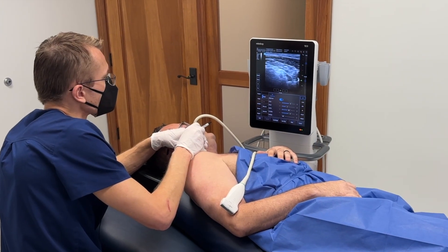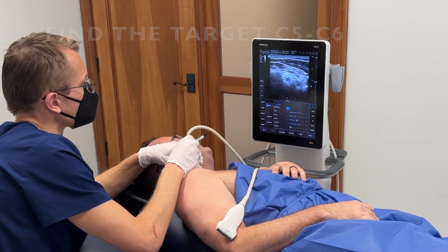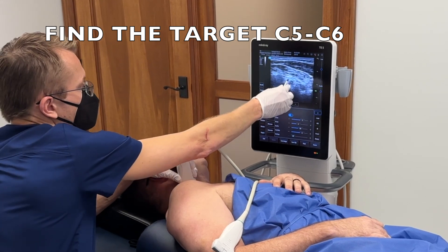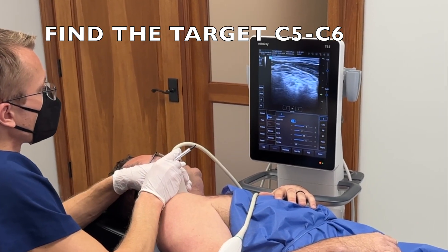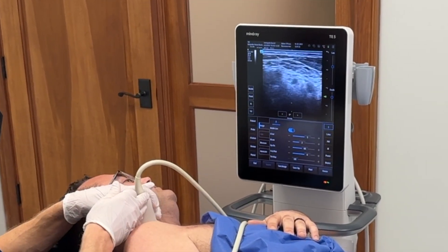So what I'm going to do first is just look at his neck with the ultrasound and identify the nerve roots. You can see C5 right here in the middle, and then I go down here and you're going to see C6 right underneath as well, and those are going to be my targets.